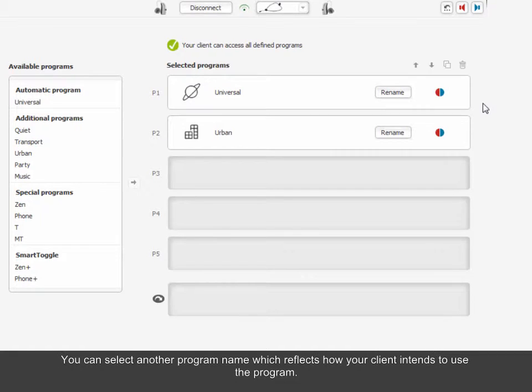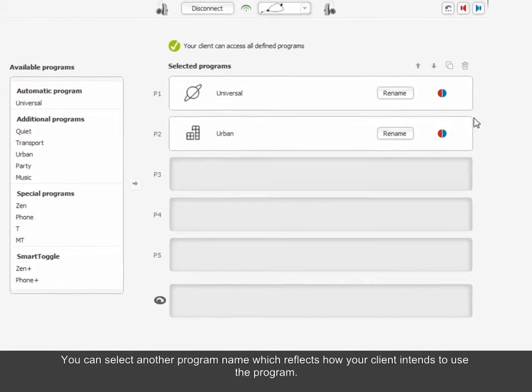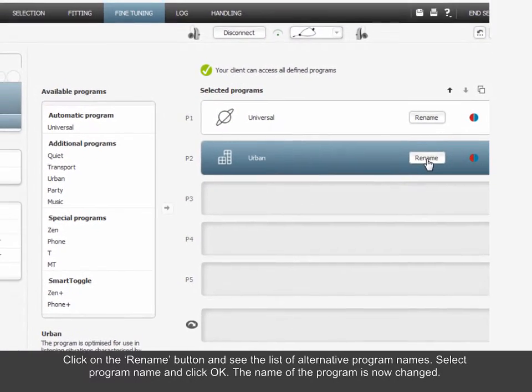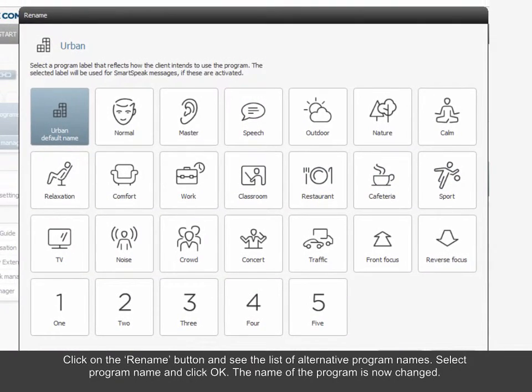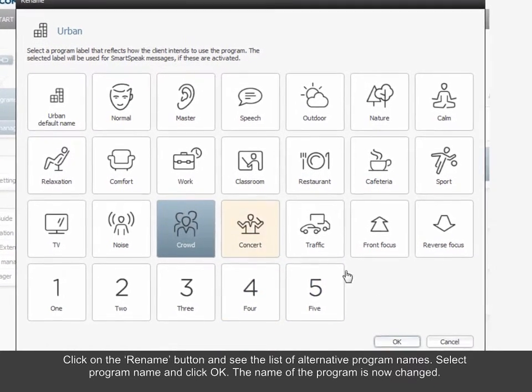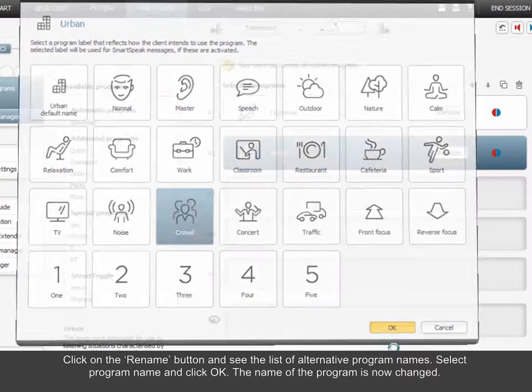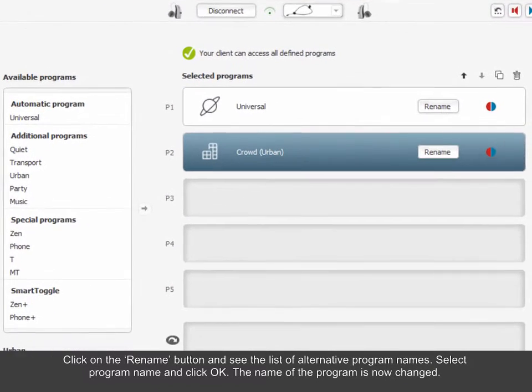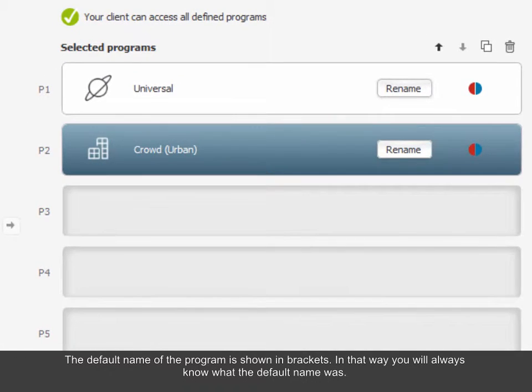You can select another program name which reflects how your client intends to use the program. Click on the Rename button and see the list of alternative program names. Select Program Name and click OK. The name of the program is now changed. The default name of the program is shown in brackets.